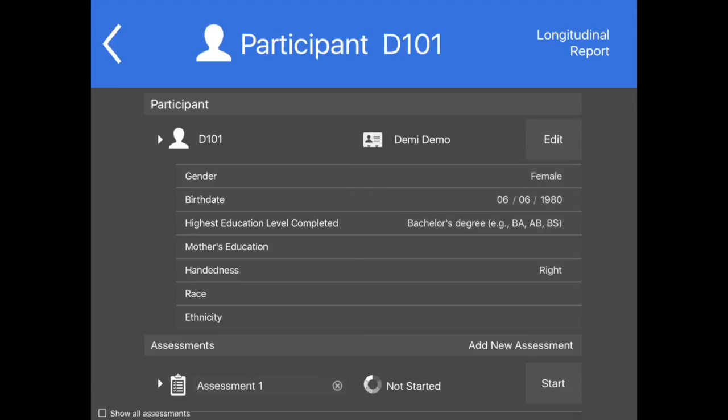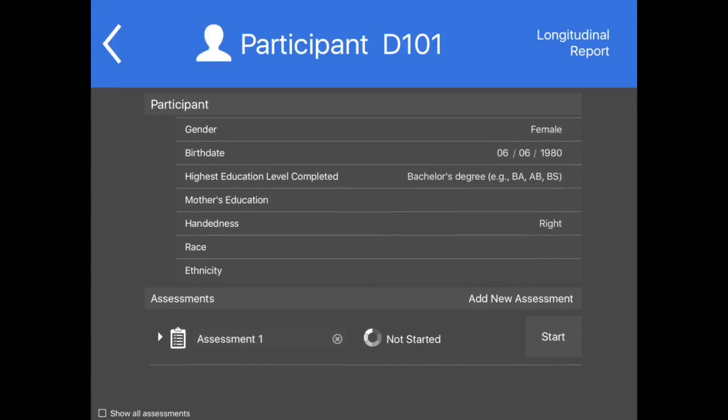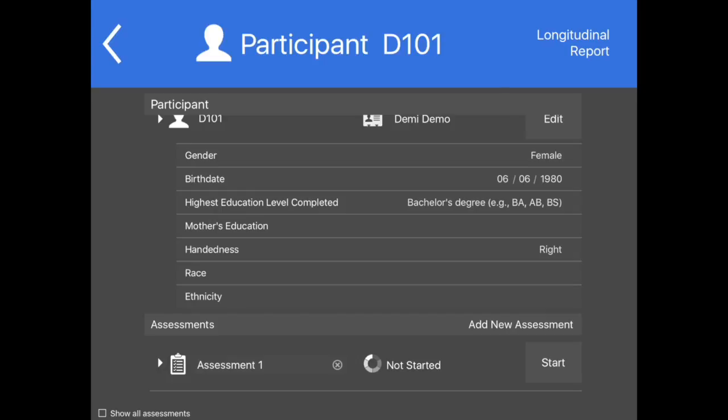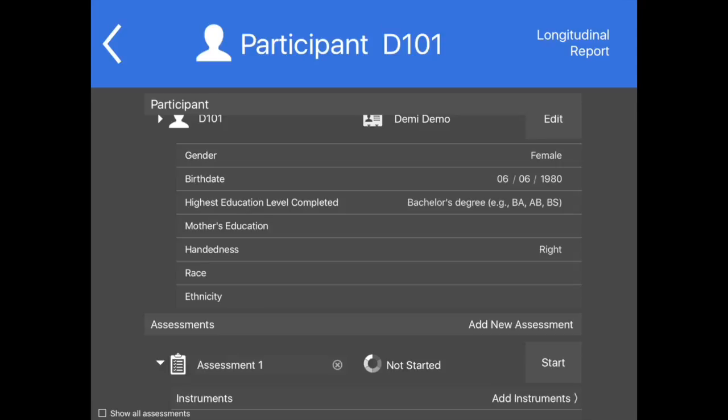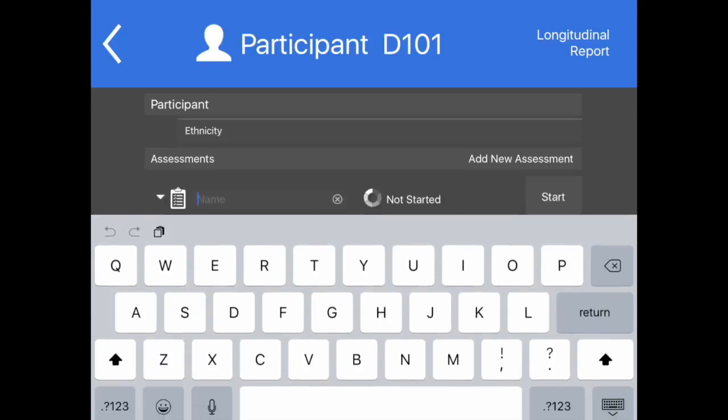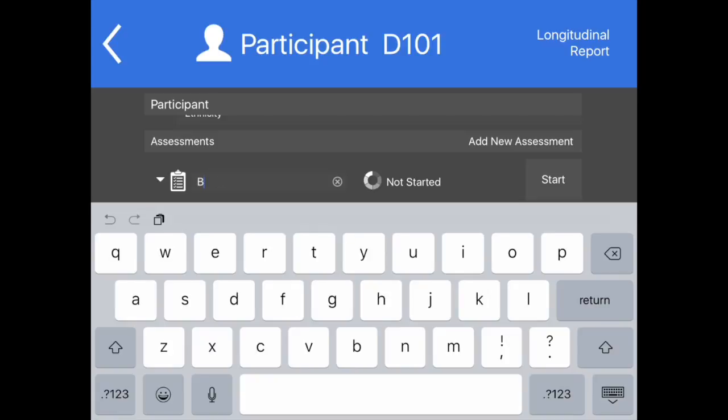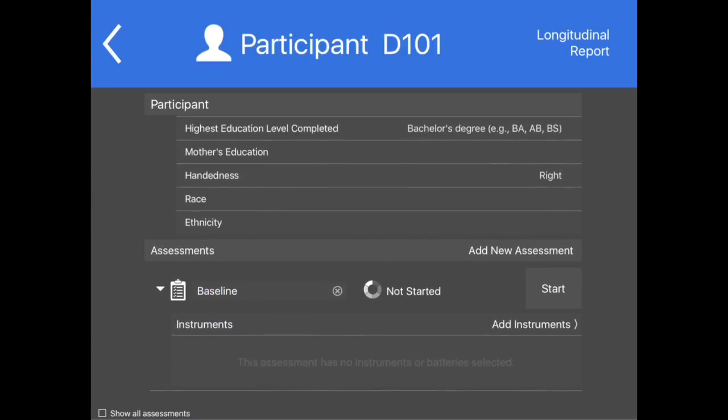To get started, tap Add New Assessment. Once Add New Assessment is tapped, the app will create a new assessment and offer the user an opportunity to add instruments to that assessment. The name of the assessment defaults to Assessment X, where X is a numeral, starting at 1 and moving up sequentially depending on how many assessments have been assigned to this participant. Tap the name of the assessment to edit it.